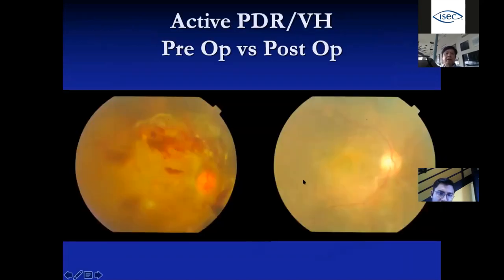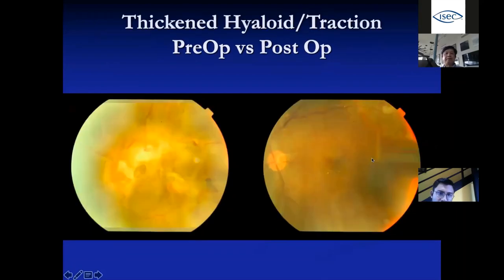Here is a case before and after operation — surgery can restore back the anatomy well. Another case shows significant distortion before surgery; timely surgery can restore vision significantly.